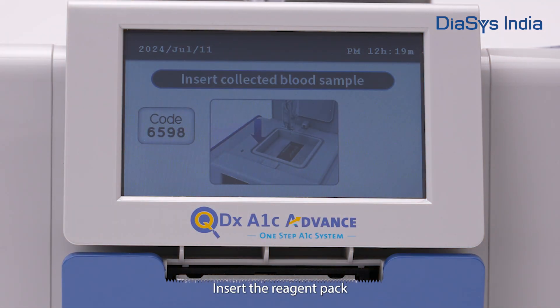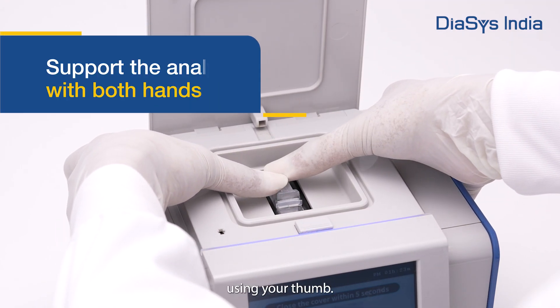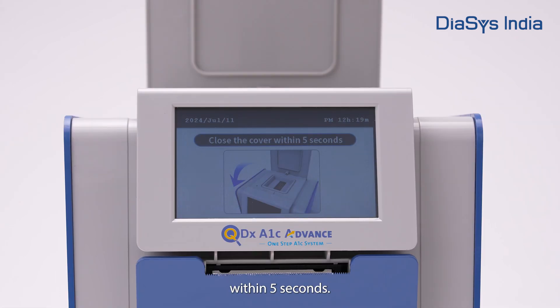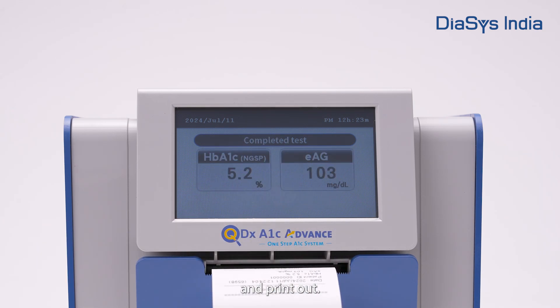Final steps. Insert the reagent pack into the analyzer with the label facing towards you. Support it with both hands and gently insert it using your thumb. Close the cover within 5 seconds. Do not open the cover while performing the test. And that's it — in about 5 minutes, your results will show up on the screen and print out.